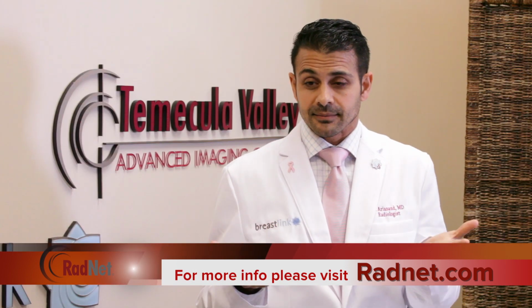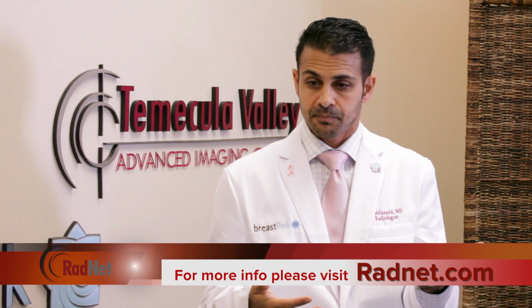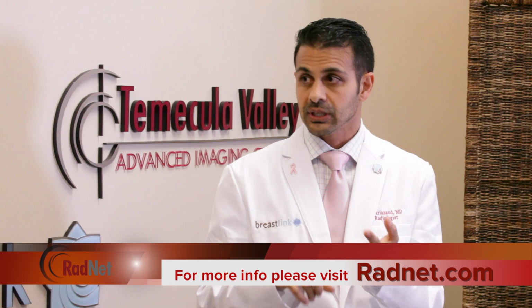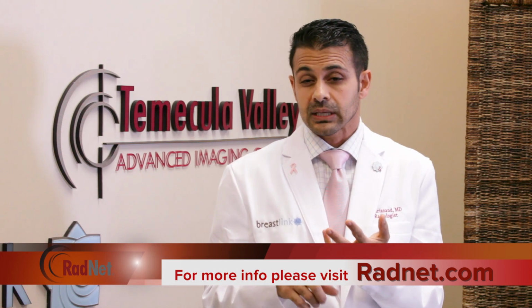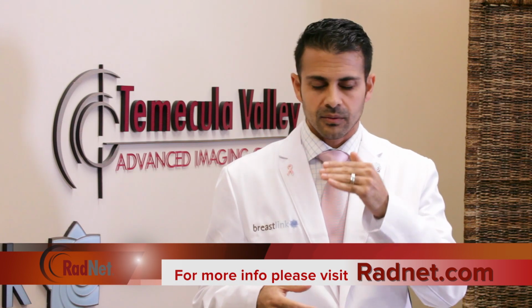Exactly. Any last things you'd like to tell anybody about all the different types of screening? Well, one thing, and I hope that I can try to do my part to teach the people in our community, is getting your screening done starting at age 40, doing it every year. And one of the important things that we don't necessarily know is, as breast imagers, old images are gold. Having an old image and being able to compare it year to year will be the way that we can find subtle differences and find cancers at an earlier stage so that their treatment will be more successful.